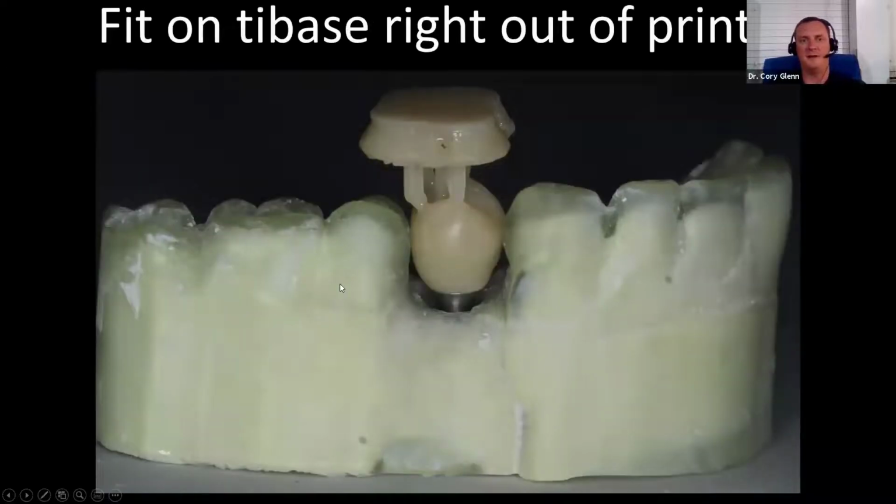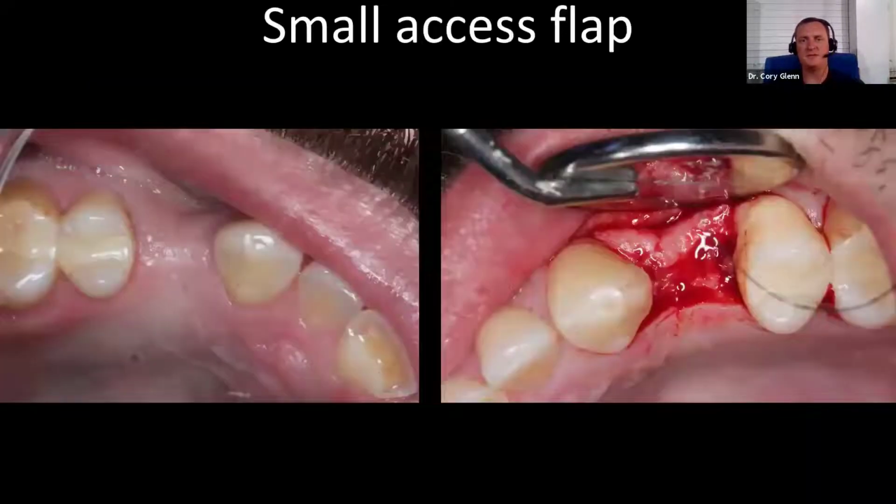And sure enough, it did. Straight out of the printer, this was no adjustments or anything. So I'm just going to remove the supports and go ahead and bond that in place, and that's going to be ready to deliver at the end of this procedure.